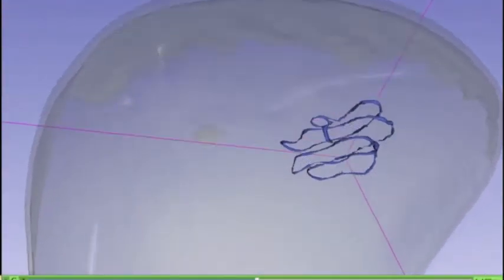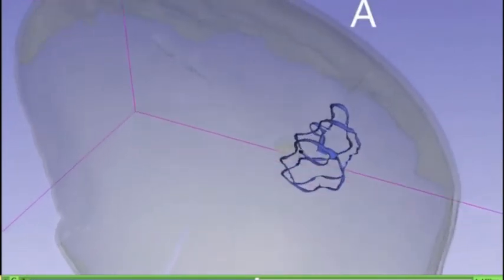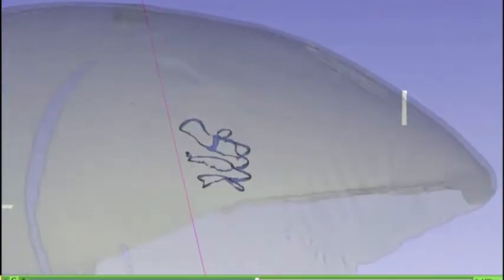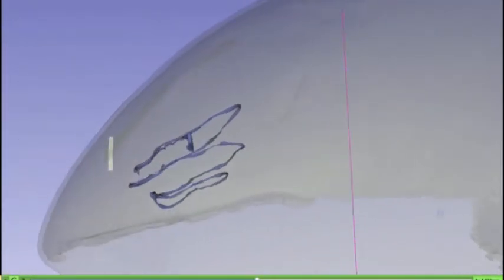The helical pattern is one of the quickest and most popular placements. This is particularly useful in simple lumpectomies with minimal tissue advancement.